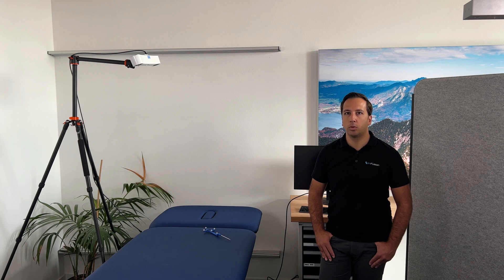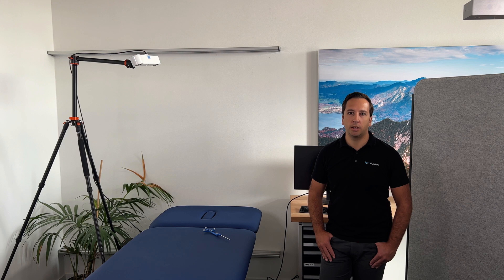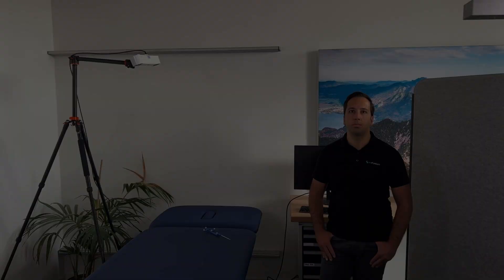The demonstrated workflow can not only be used for the knee application we will be showing next, but also for numerous other applications in implant or needle guidance. Now let's start with the demo.